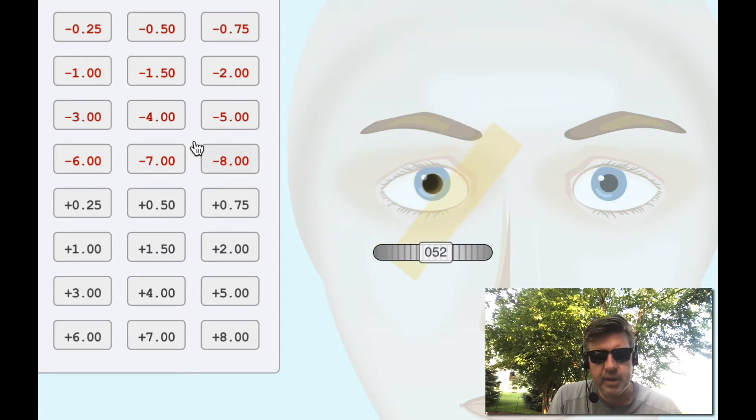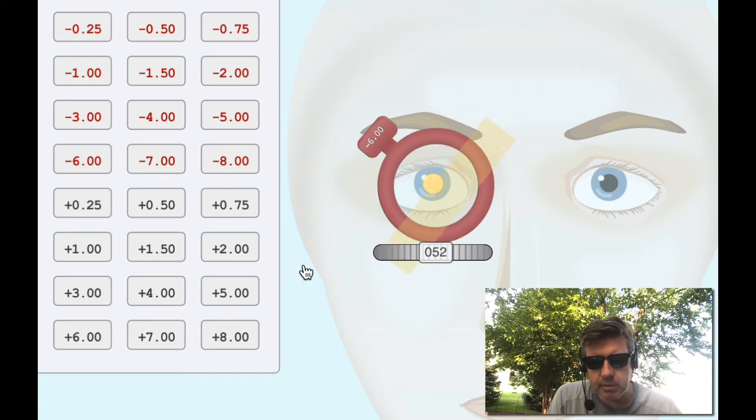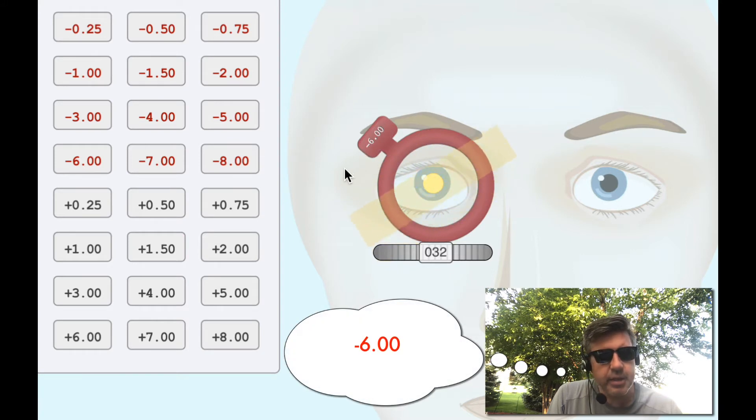Let's get this five out of here — I'm going to throw a six in there. Yeah, this person is fairly nearsighted. I'm trying to spin this axis. That looks really neutral there at 32 degrees. Let's add another quarter just to see what happens — I definitely see a little bit more motion there. With plus a quarter, the motion increased too. So I like minus six. I'm going to remember minus six at 32 degrees.